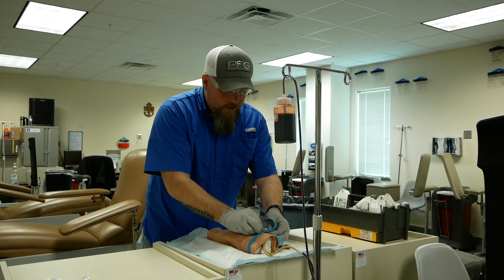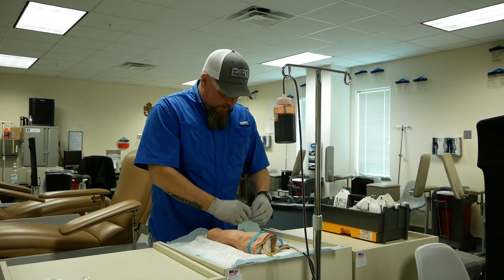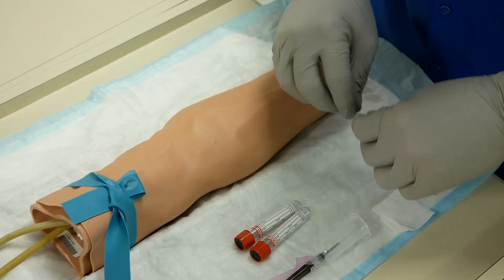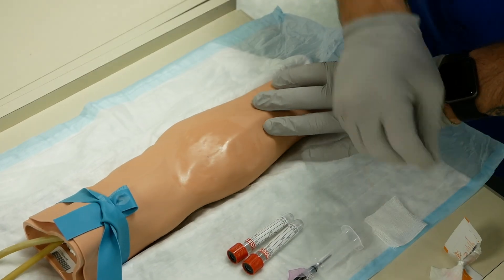You always want to tell them to make a fist. You're going to find your vein one more time and clean the site. Start in the middle, work your way out approximately two inches, never crossing over the same area twice. Allow that to dry and monitor the site to ensure that you don't touch it again.